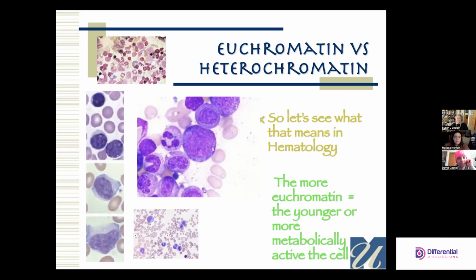So if you worked in a lab that was too cheap to get you an ocular micrometer for the hematology lab, and somehow micro always got them, but heme almost never did, you used the small lymph to check the size of your red cells.